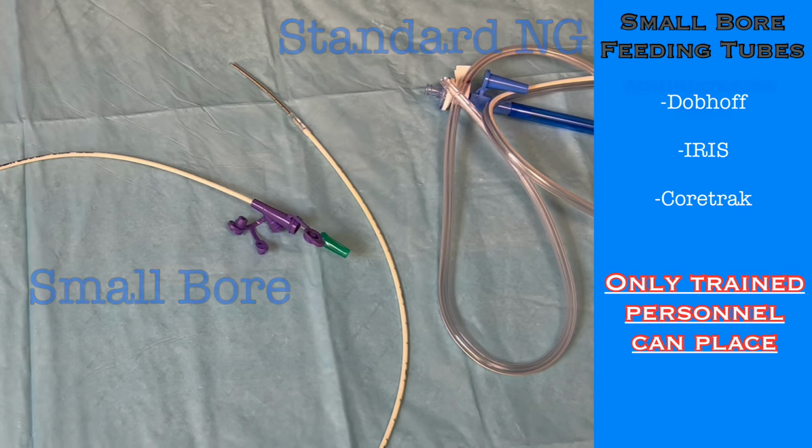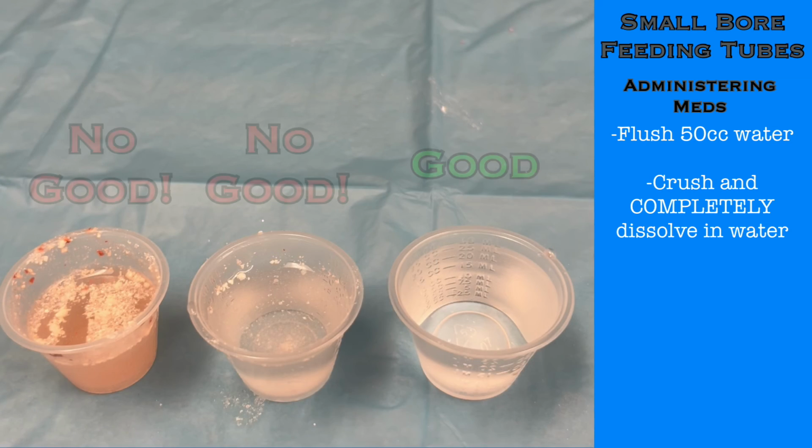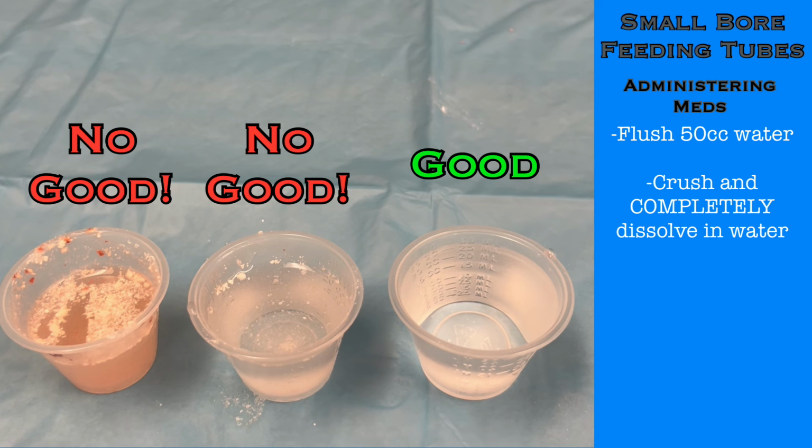Due to their extremely small size, extreme care must be taken when administering anything through the tube, or you risk clogging the tube. If you must administer medications through this tube, first, flush with 50 cc's of water. Then crush and completely dissolve the medication in water. There can be absolutely no sediment in that fluid.